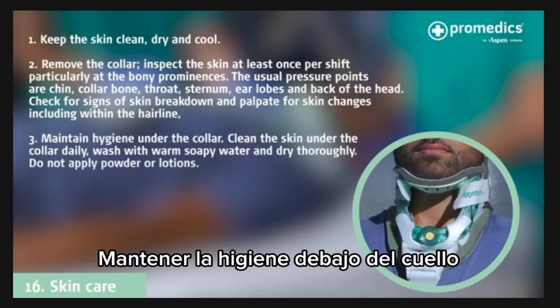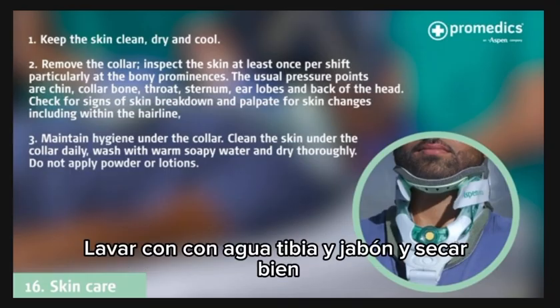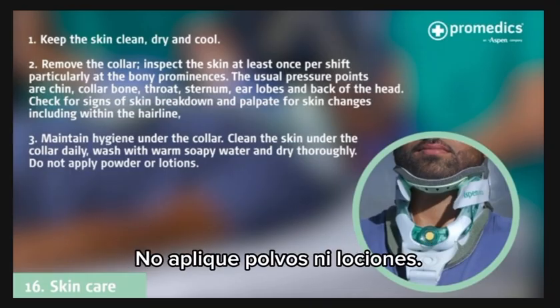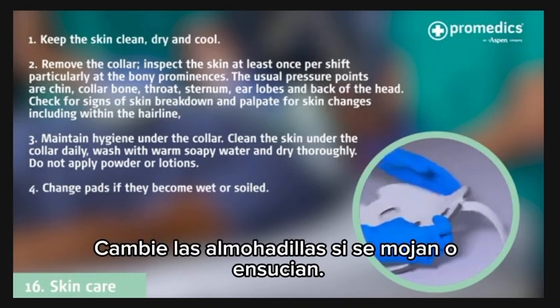Maintain hygiene under the collar. Clean the skin under the collar daily. Wash with warm soapy water and dry thoroughly. Do not apply powder or lotions. Change the pads if they become wet or soiled.